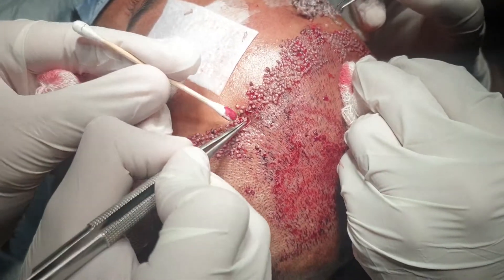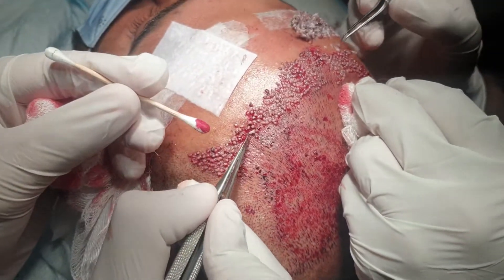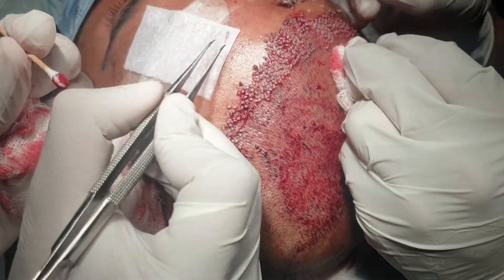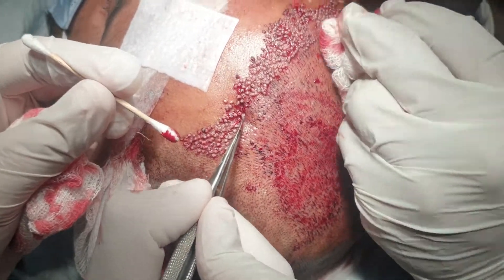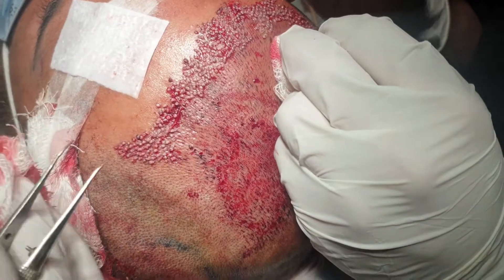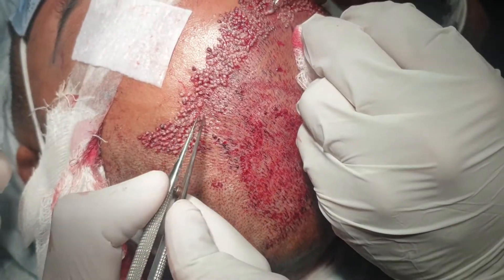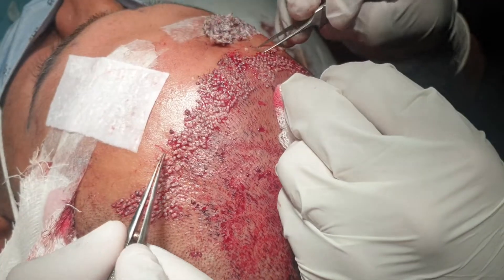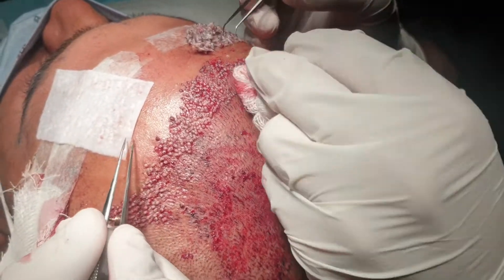At the time of inserting these grafts, you can see we try to arrange them on sheets so that we can practice some economy of time. We always follow a certain order — the order in which holes were created — so all workers follow those particular orders so that we don't skip a hole.